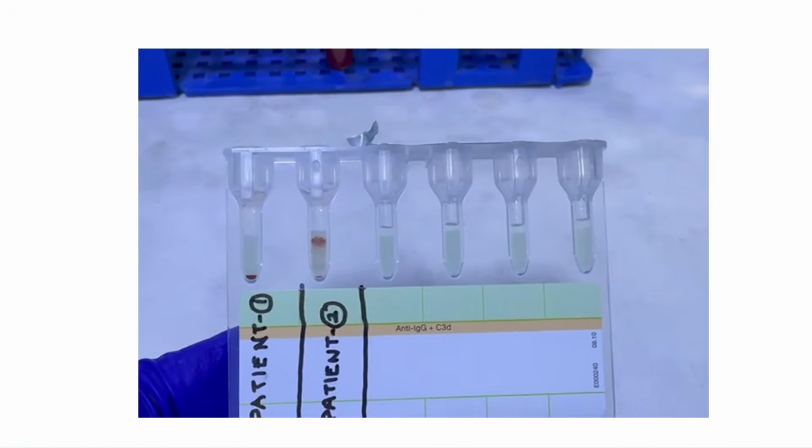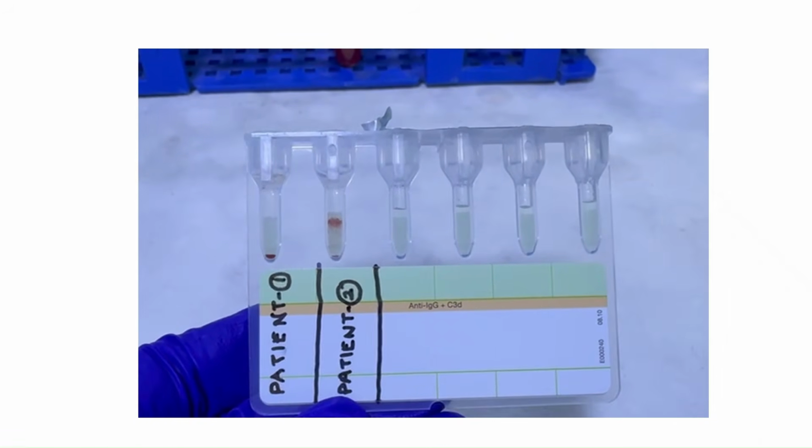Coming to results, here we can see for patient 1 all the red cells have settled down to the bottom, hence it is negative. For patient 2 the red cells are in the upper half of the gel card, hence it is 4+ positive.